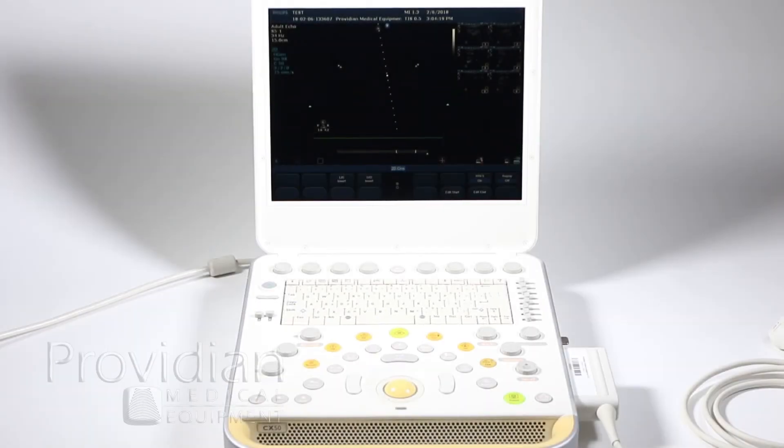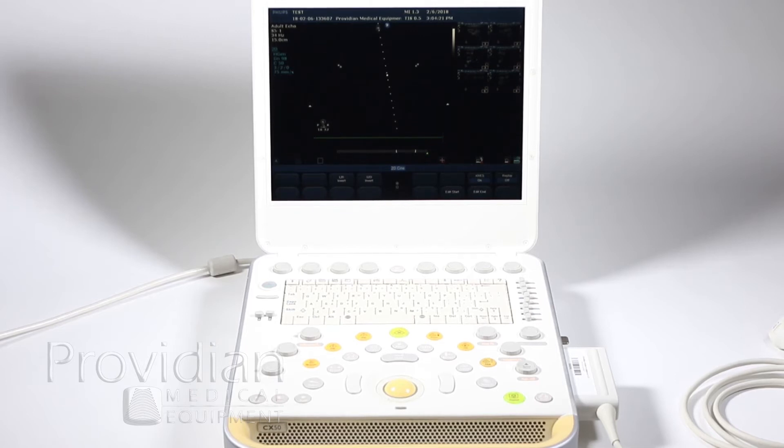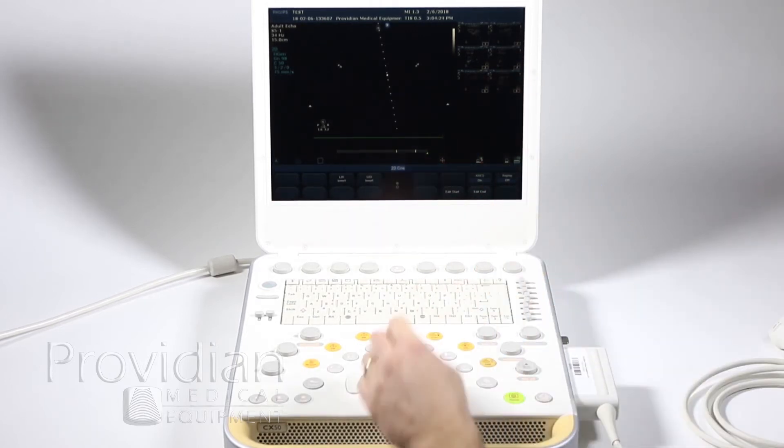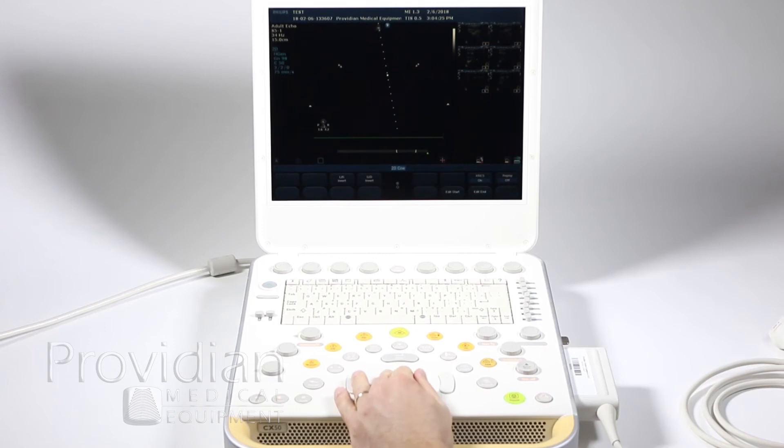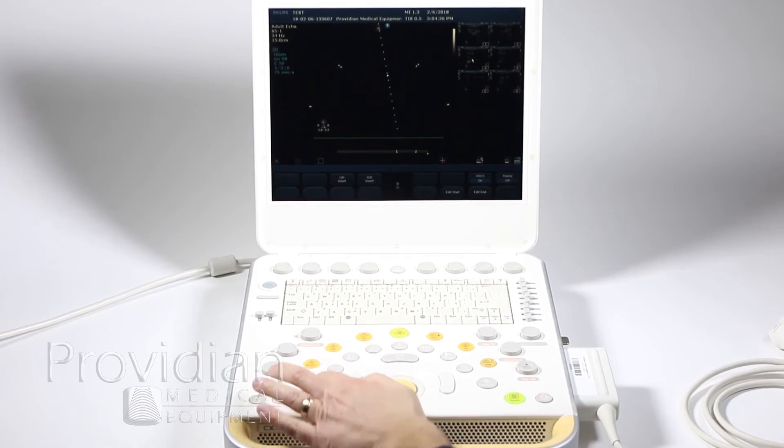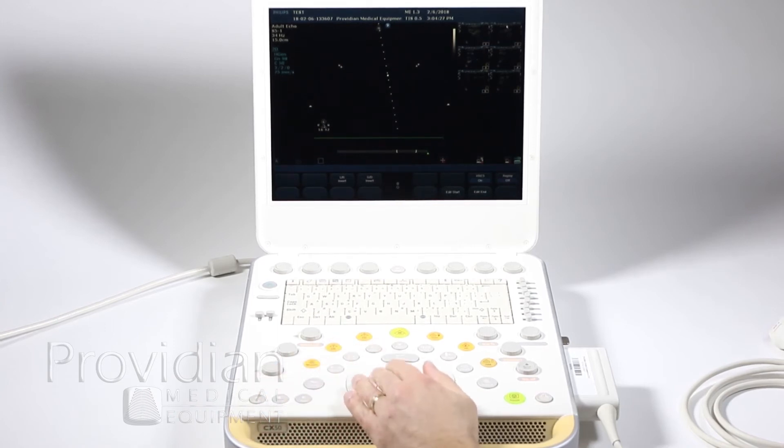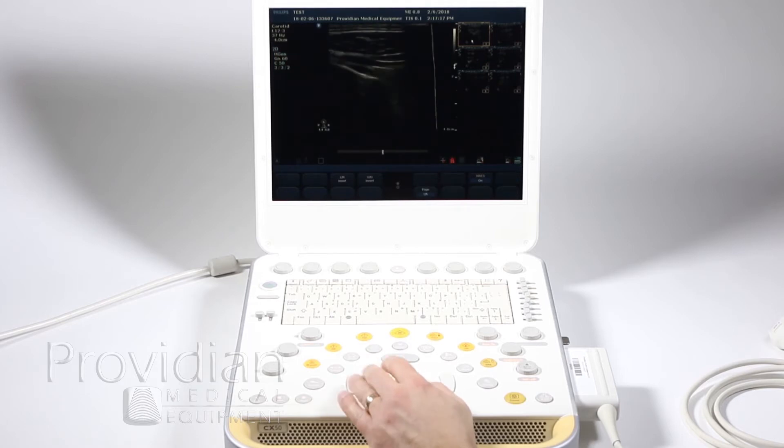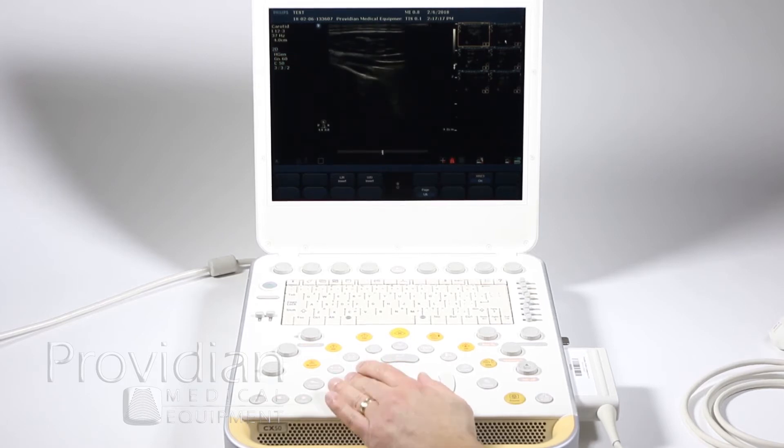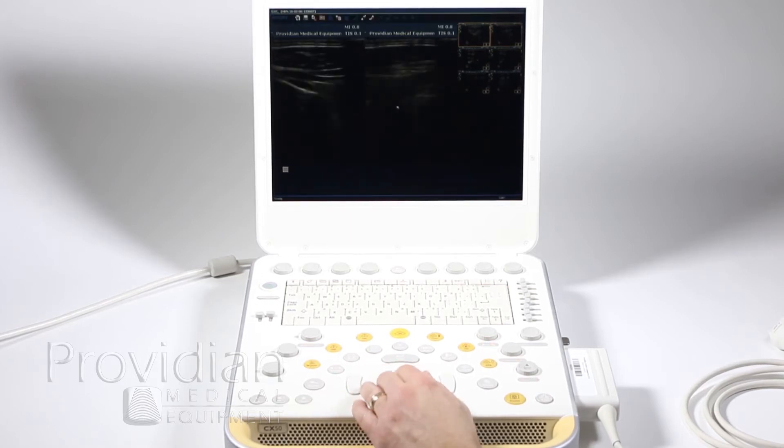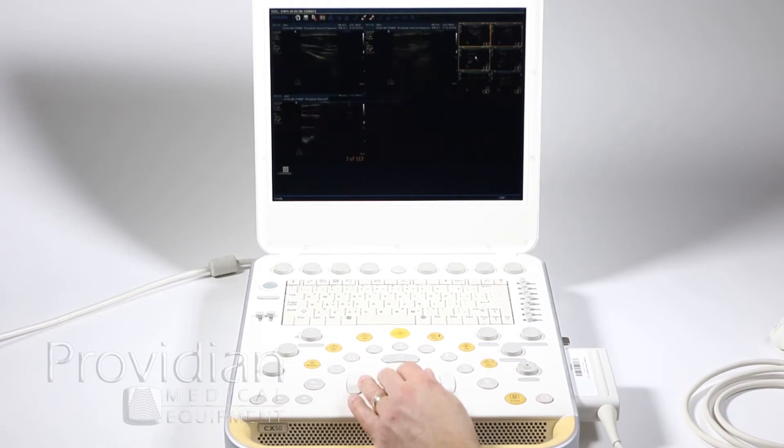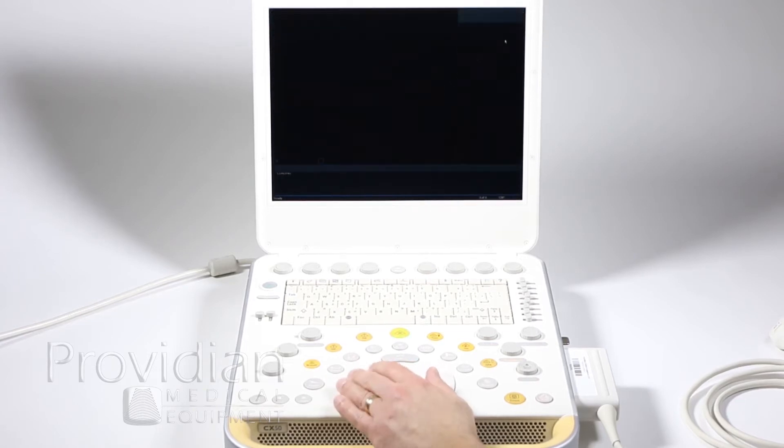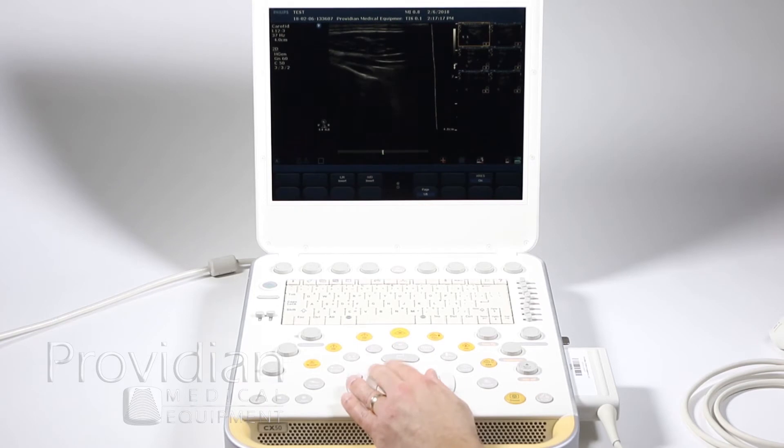Okay, we've already touched on some of the image review capabilities while you're in 2D. We went up to this screen over here, hit the pointer, and you can left double-click to get that back up on the screen. You can select another and get them side by side, keep selecting them or deselect them.